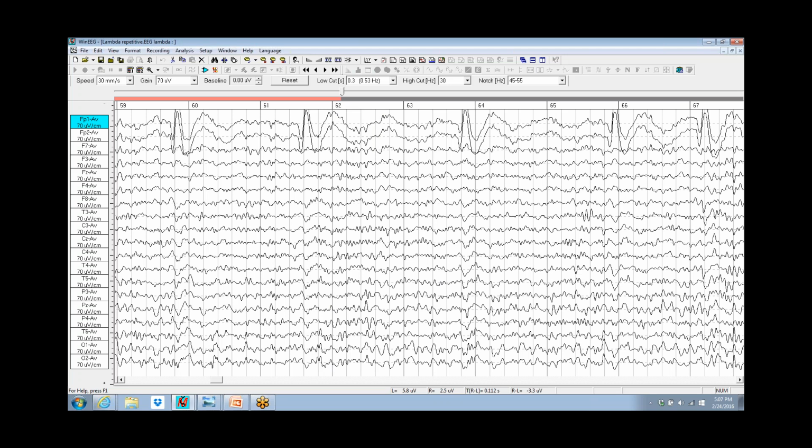Over time, the EEG averages out. And as such, if we give a series of stimuli and we time lock a recorder to the presentation of the stimulus, we can then actually get the response to a stimulus.